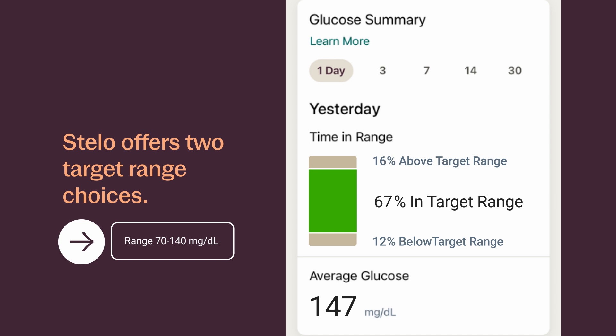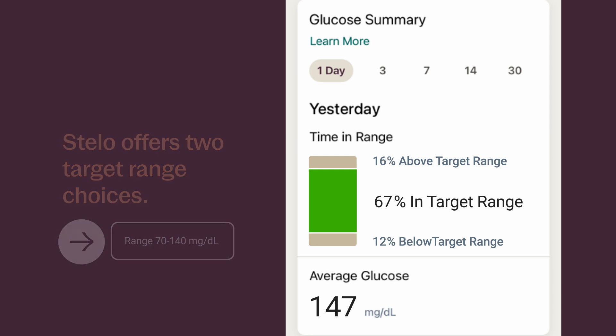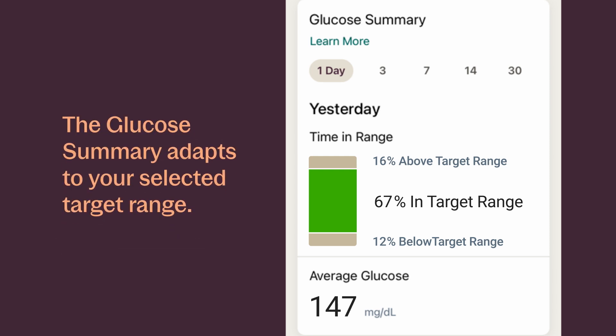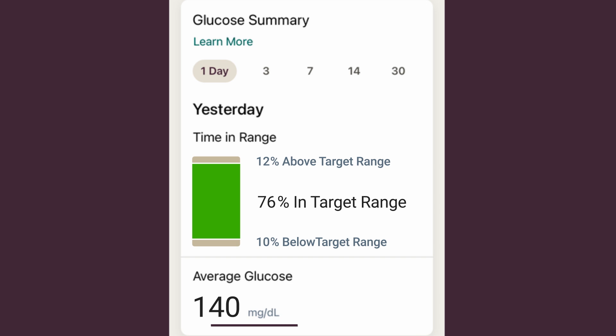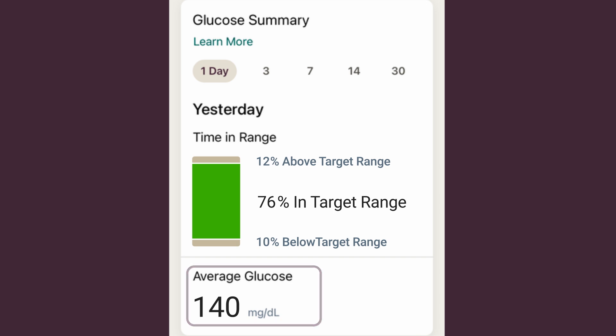If you notice you're spending most of your time in this range, you might want to consider moving to 70 to 140. The glucose summary adapts to your selected target range. The more time spent in the target range, the better. Another key thing in the glucose overview is your average glucose — the average of all sensor readings from your selected date range. Knowing your average glucose gives you a good place to start when trying to get your numbers into target. And that's how you read your Stelo home screen.